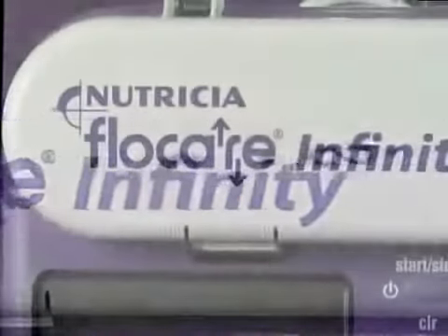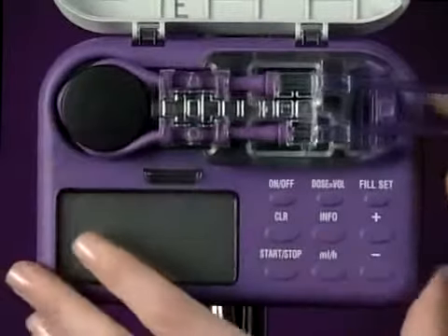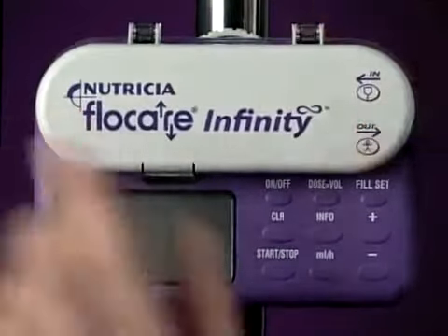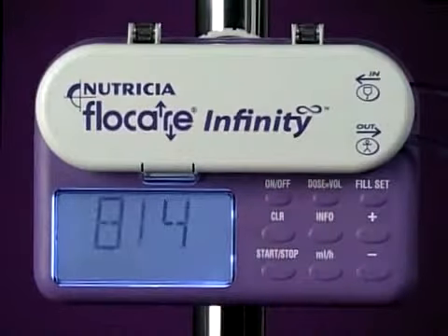Flowcare Infinity pumps represent a significant breakthrough in enteral feeding pump technology. The Flowcare Infinity is a compact and lightweight pump that's very simple to set up and, with its user-friendly interface, equally easy to operate. A combination of features that makes it suitable for both bedside and portable use.